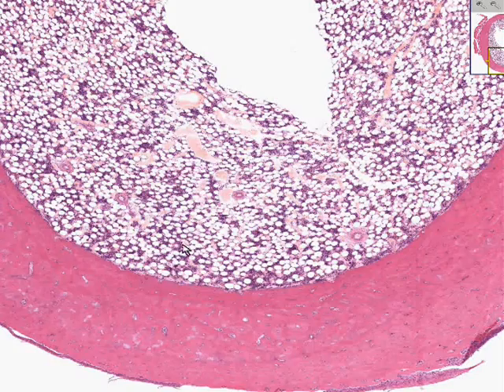In addition, bone has marrow. Bone marrow can be 100% fat, in which case it will not make hematopoietic cells, or bone marrow can be approximately half fat, like you see here, and half cellular, which is the normal general ratio for hematopoietic bone marrow. In adults, hematopoietic bone marrow is primarily limited to the axial skeleton, and the appendicular skeleton, the distal extremities, is primarily non-hematopoietic marrow, or 100% fat.